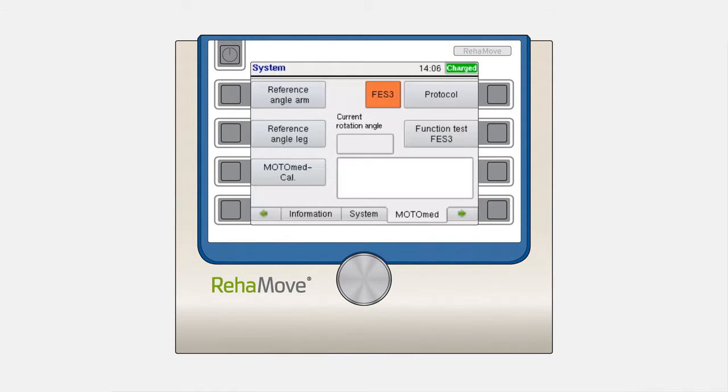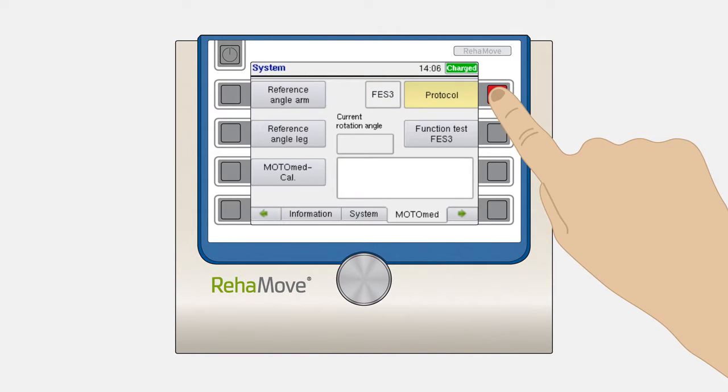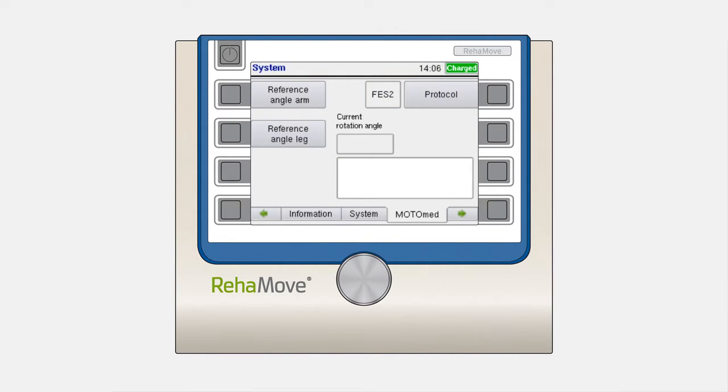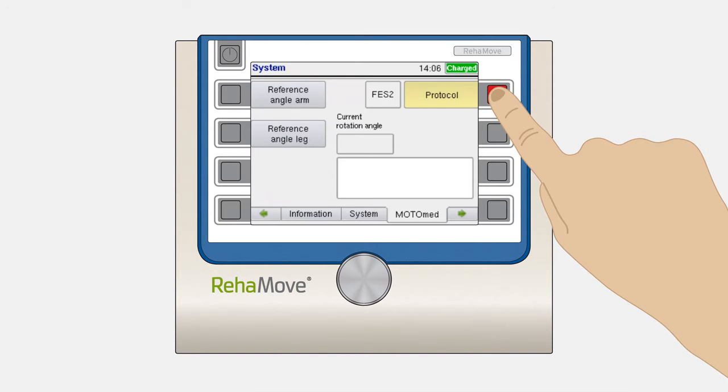Next to the Protocol button, you can read which protocol is currently activated. By pressing Protocol, you can change between FES2 and FES3.